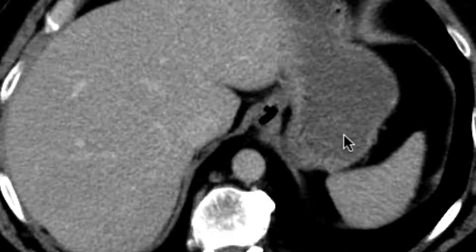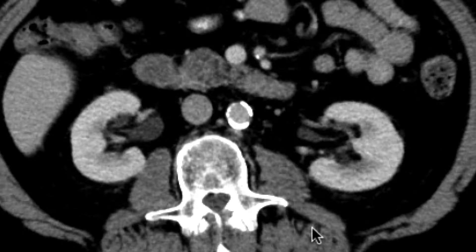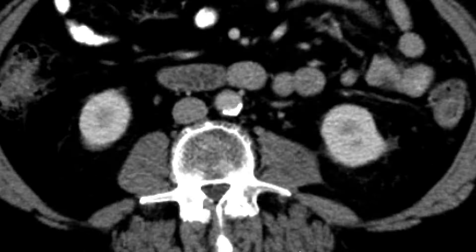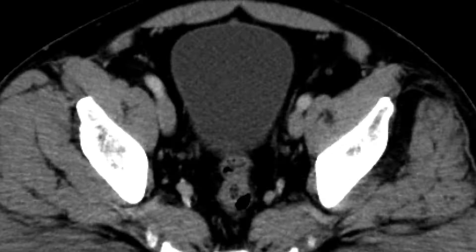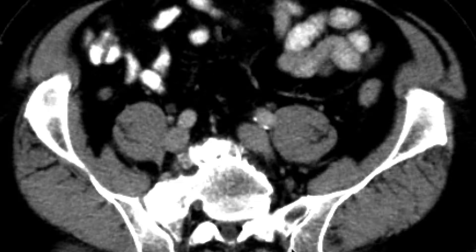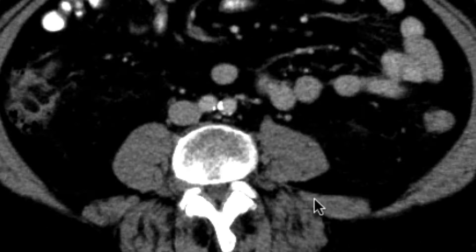We ended up getting a CT scan with intravenous contrast, and we'll go right to the area of concern that we want to focus on, which is the right lower quadrant, the cecum, and the appendix.